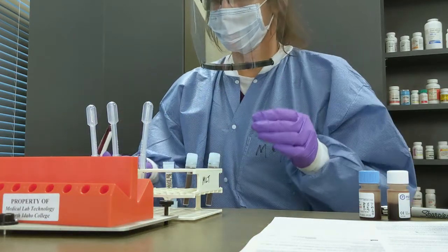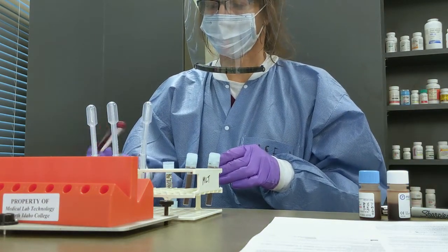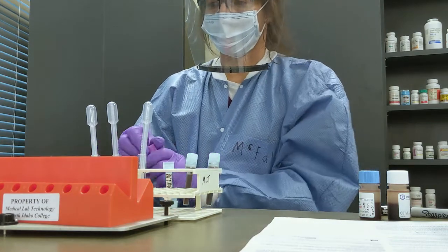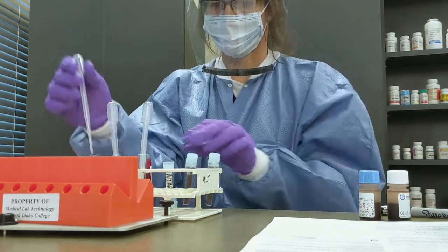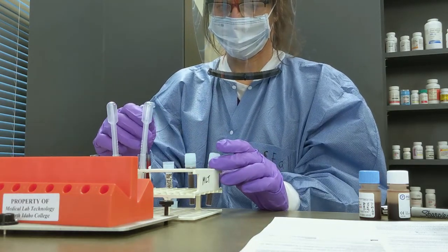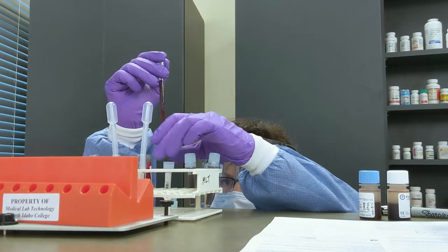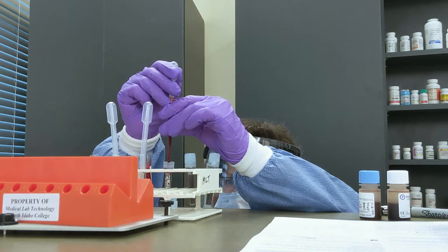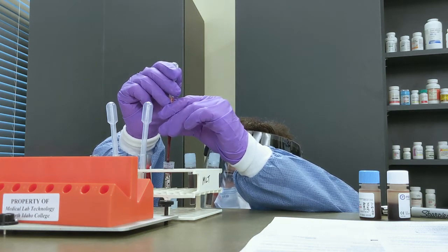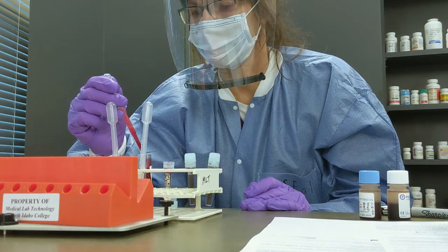We do have analyzers that can also perform this test, and those can be done within about five to ten minutes. This test checks for inflammation in our patients. There is a more specific chemistry test — C-reactive protein — which is a more specific indicator of inflammation, but ESR is still quick, easy, and cheap to do, so many physicians still like to order it.